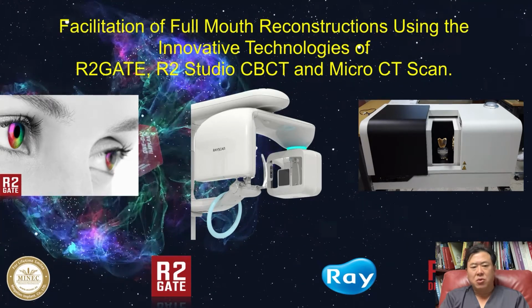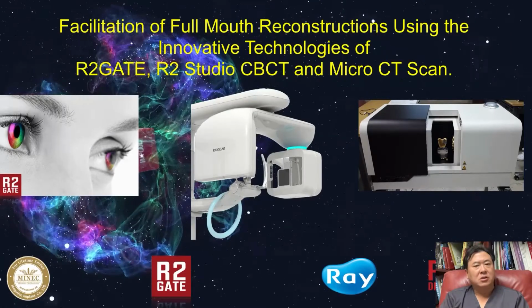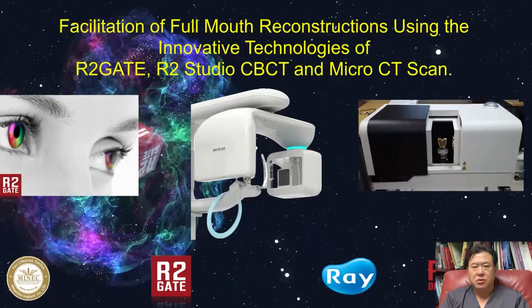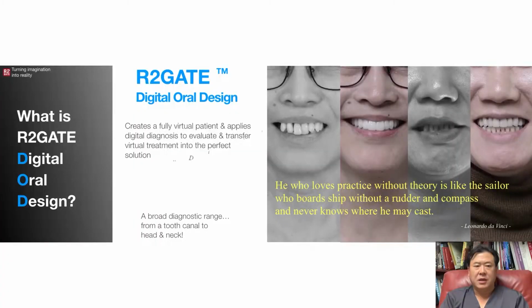With this important notion in mind, I would like to present about facilitation of full mouth reconstruction using the innovative technologies of R2GATE, R2 Studio CBCT, and micro CT scan. Dr. J.C. Kim, the creator of R2GATE, described R2GATE in this page. R2GATE is composed of two parts, restorative and surgical planning softwares.